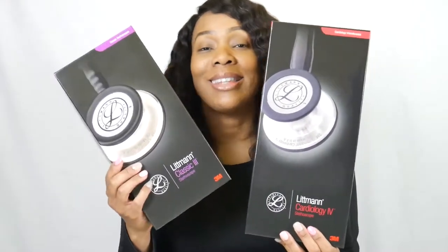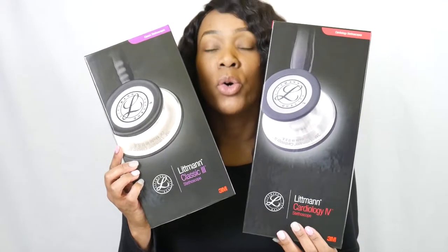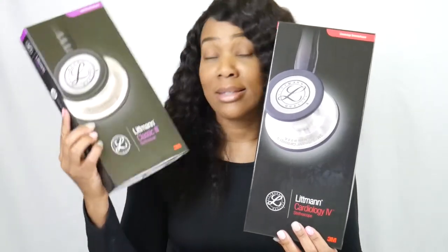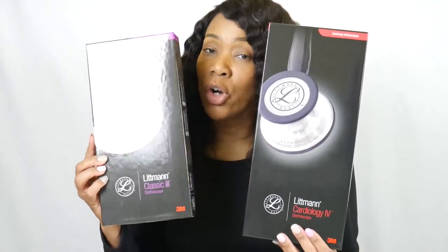So I have two stethoscopes here. One is the Littmann Cardiology 4 and the other is the Littmann Classic 3. The Classic 3 is identified as the monitoring stethoscope, whereas the Cardiology 4 is described as the diagnostic stethoscope.